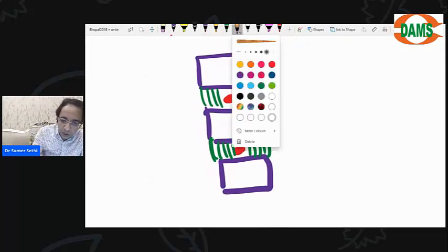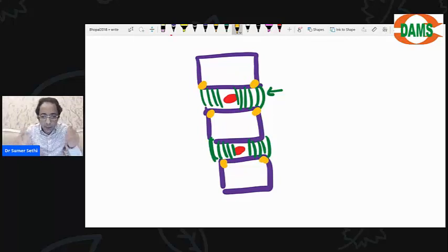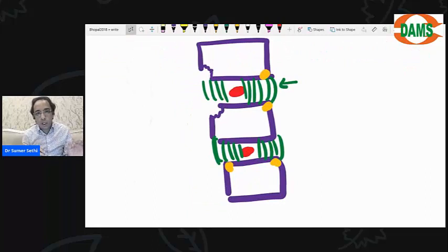Now, please listen to me carefully. It is just to listen, otherwise, you will miss the bus. The outermost disc fibers are inserted in the vertebral corners. So, in the acute stage, this will cause inflammation and destruction of the corners. भाई कहीं पे भी कोई फाइबर इंसर्ट हुआ, technically that is an enthesis. So vertebral corners are actually an enthesis on which the outermost disc fibers are inserted.